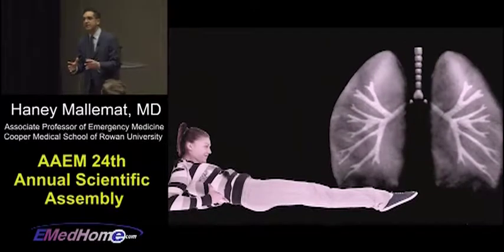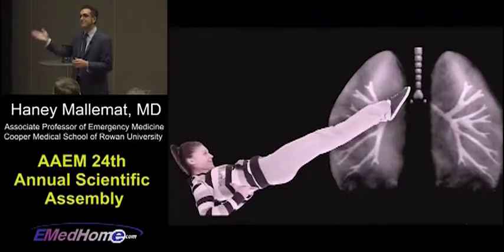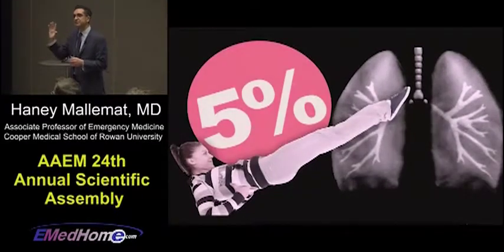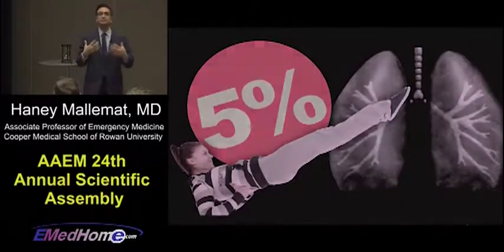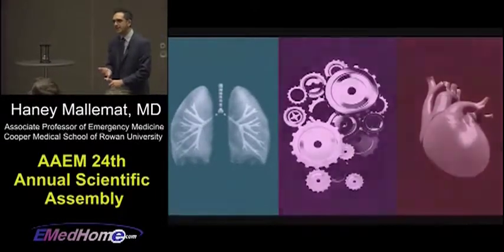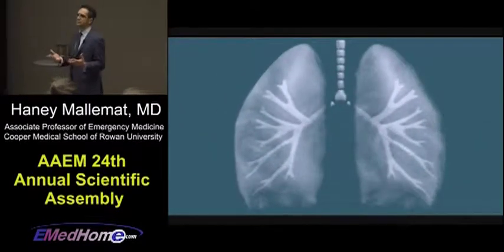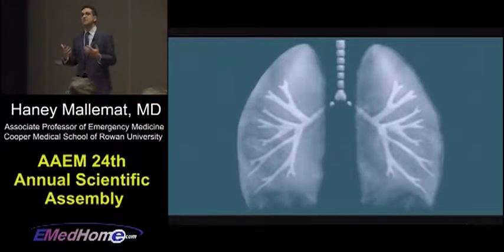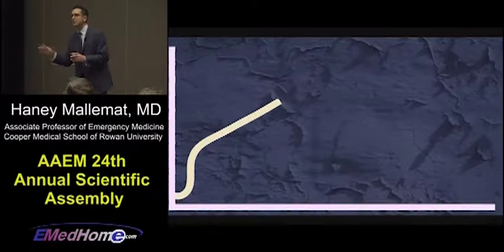Now, what you might not know is you can use this for volume responsiveness. If you have a patient and you give them a passive leg raise and an increase of 5% is noted on your end-tidal CO2, that is synonymous with a patient who's volume responsive, so go ahead and give them fluids. So we talked about metabolism, we talked about the cardiovascular system. Let's talk about one of the biggest uses we use end-tidal CO2 for, and that's the respiratory system. And I want to review some waveforms that might come up that help you with your patients.